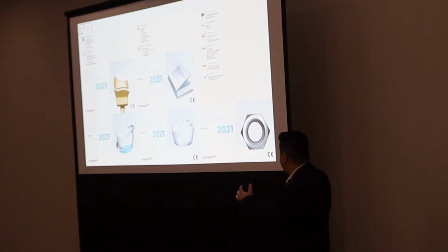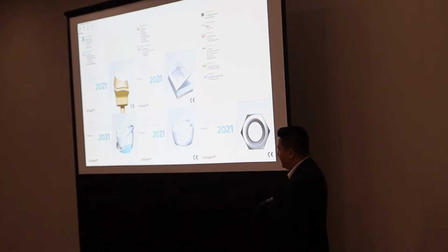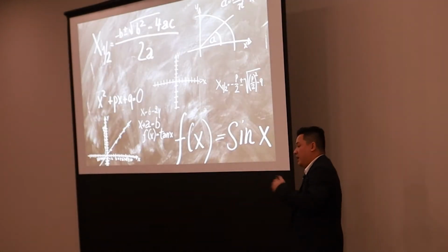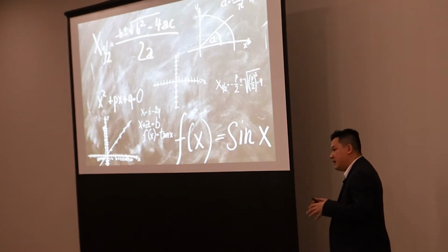Right? You have Model Builder, Scan It this, Control Panel that, they have annual releases, different updates. So trying to wrap your head around that, it may not be very apparent if you're just jumping into it. But what I like to do is, going back to fundamentals, we'll take a quick step backwards to basic grade 10 algebra.